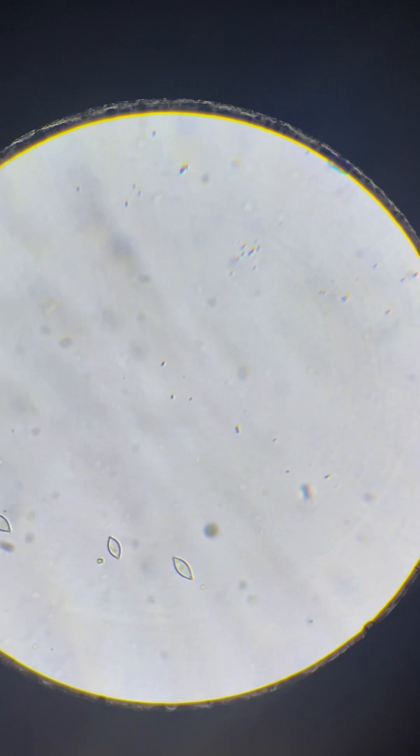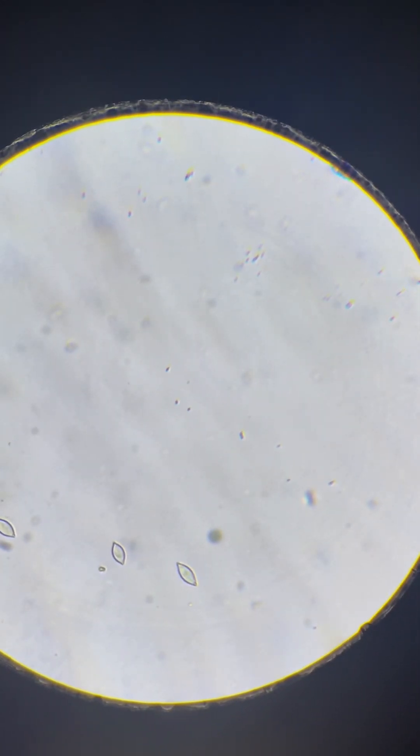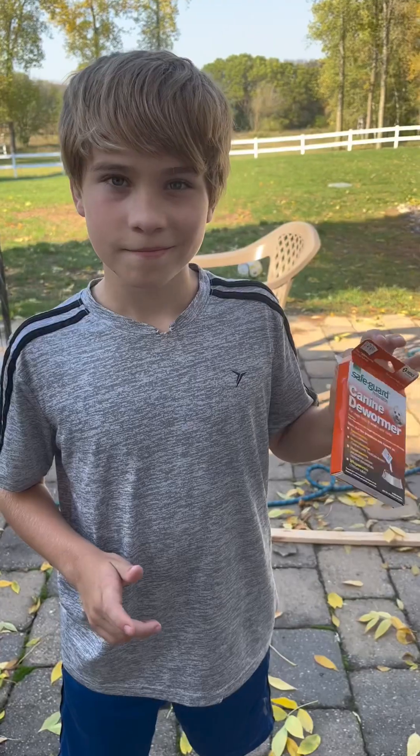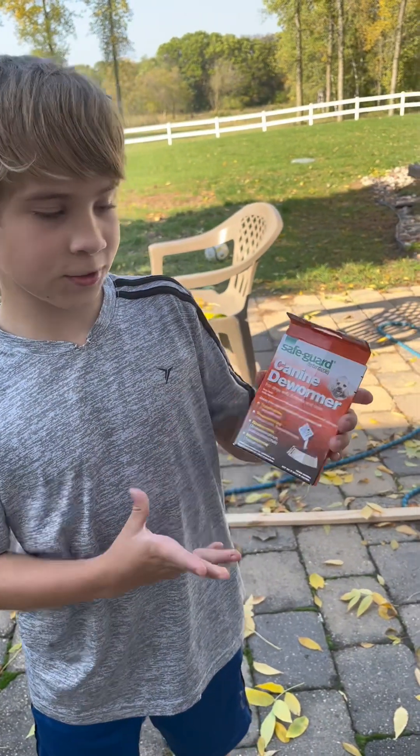It looks like we found some intestinal parasite eggs in our chickens — we will be treating accordingly. Because we found capillary worm eggs on our chickens, we're going to treat them.